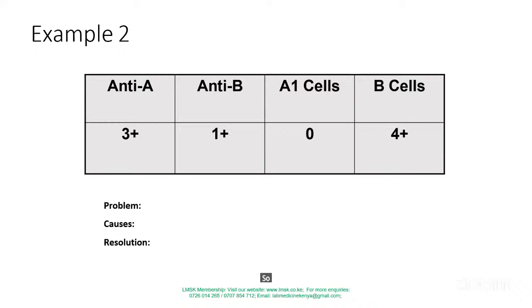So Dan is clarifying, saying insufficient serum sample was used for the first one, not the second. Okay. Thank you, Dan. Is there any other person? Okay. To you, Francis. George Nyabuto is saying expired reagents.